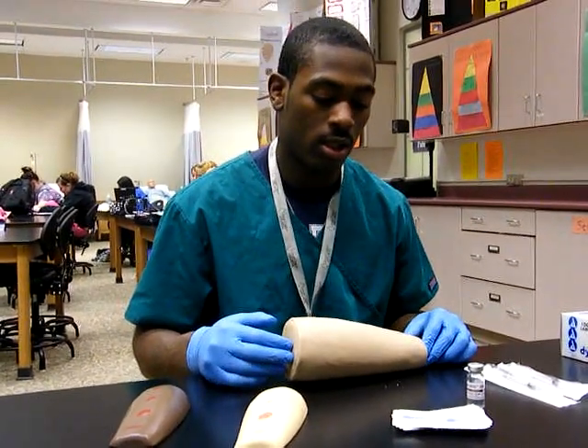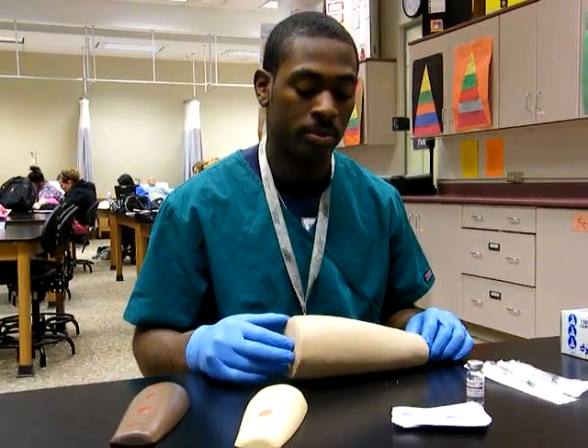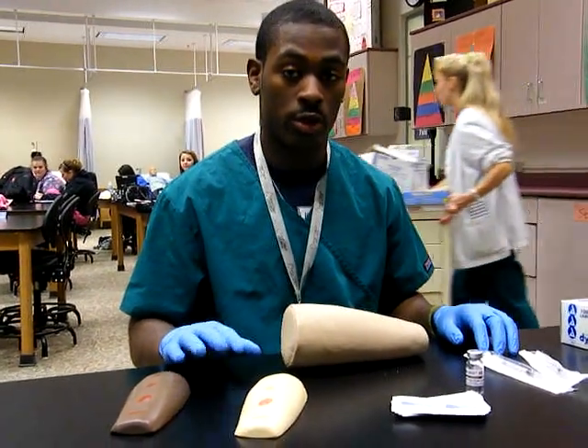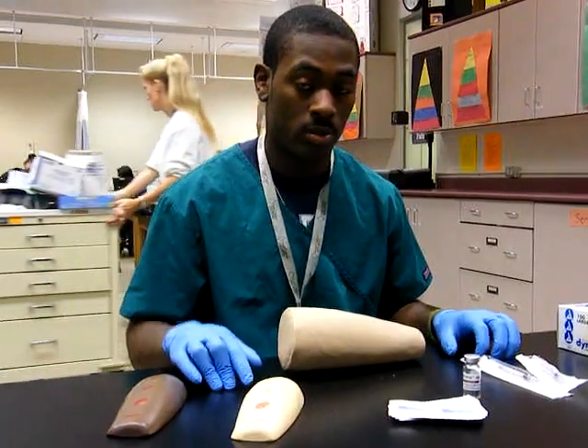My name is Kabel Henley, and I'm from Great Oaks, Laura Oaks, and I'm currently about to get a TV shot.